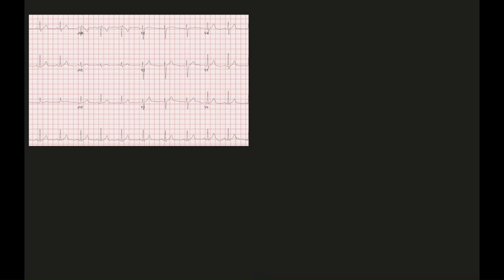Today's video is very important as it will give you the basic knowledge of ECG. It does not matter if you are an intern, medical student, house officer, or a resident. I will start from the basics. The initial portion of this video will be for interns and medical students, and then we will move further into more complex cases or more complex explanations. So we will start with the very basics of the ECG.